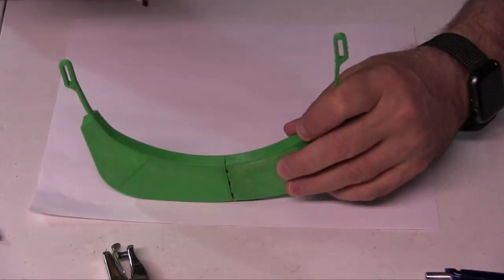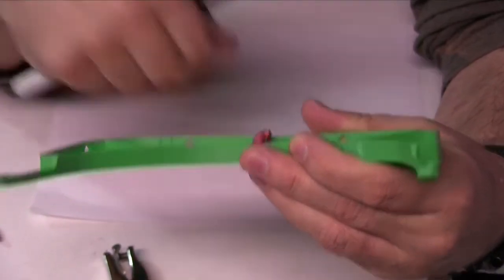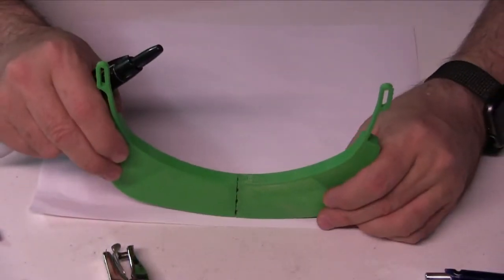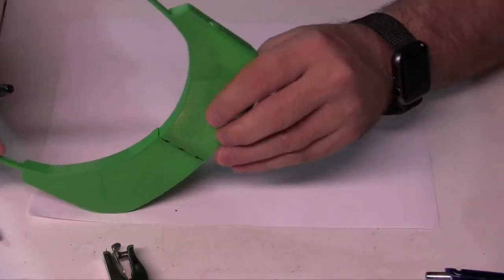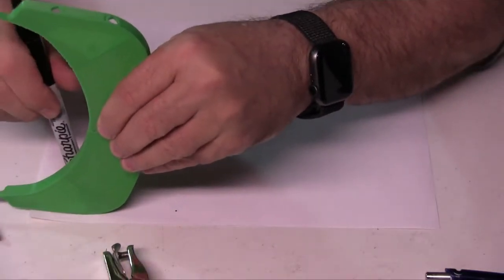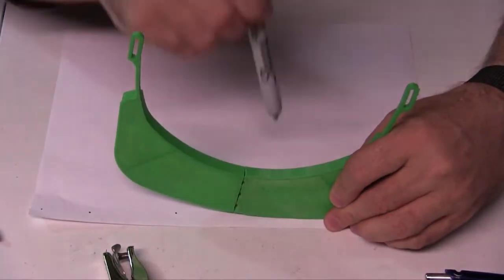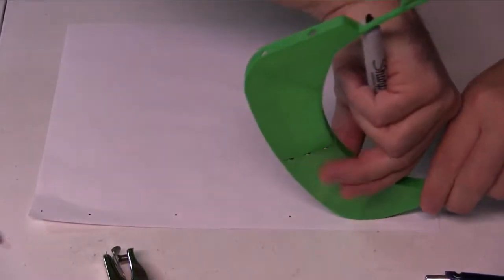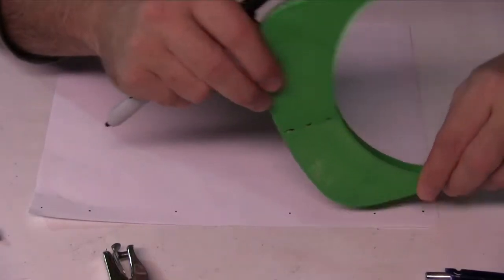You're not seeing the inside of this, but looking at the inside here, I'm going to be making marks through these holes all the way around, and they'll appear on the piece of paper. So I'll put that where I want it. Make sure that it's going right across evenly. So there's a mark, and then I'm going to mark there and there, rock back, and mark there, and there, and there. And as I remove this, what you're going to see is I've created a template that has these markings right there that are where those holes are.